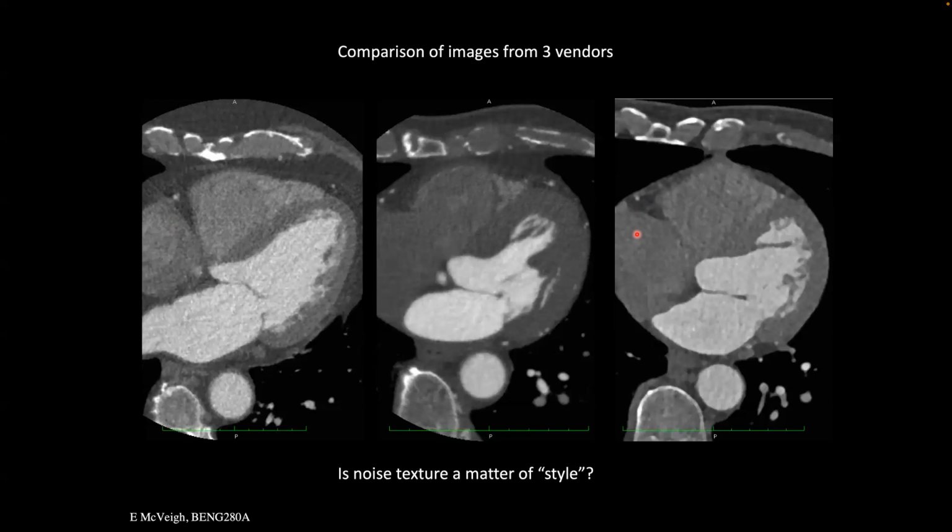So radiologists go up and down, they'll have, say, 256 slices that look similar to this, and they roll up and down, as we'll see in a minute, through the heart and look at those vessels. So that's one thing. Another thing would be, where is the boundary between the blood and the myocardium? Precisely, where is that boundary? That's another thing you might want to do with this data.